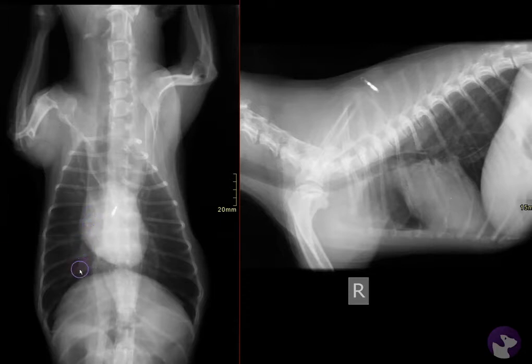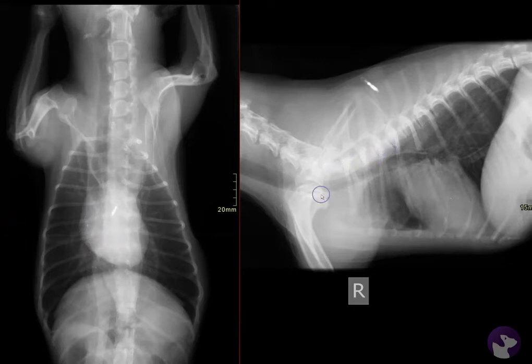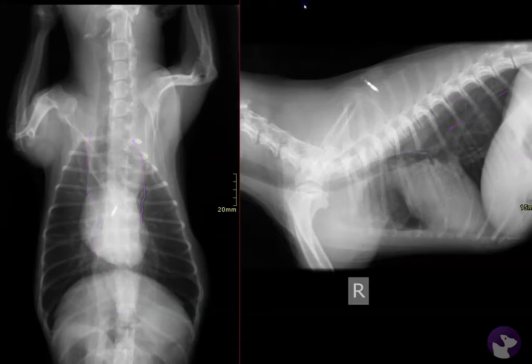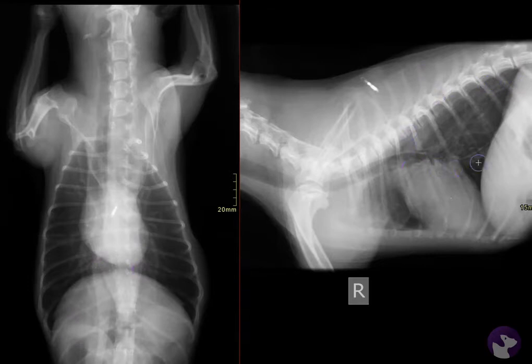Radiographs were taken of this patient, and what we see here is that the esophagus is diffusely distended, predominantly with gas. The esophagus is visible both in the ventrodorsal projection and in the lateral projection caudally. It's really easy to see in the ventrodorsal projection, a little bit more challenging in the lateral.